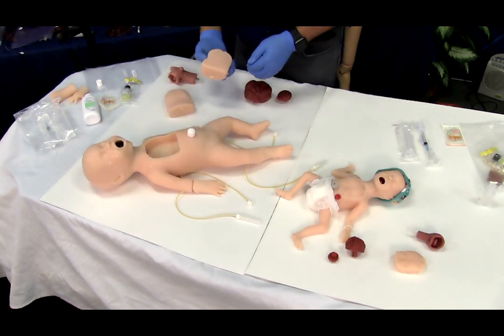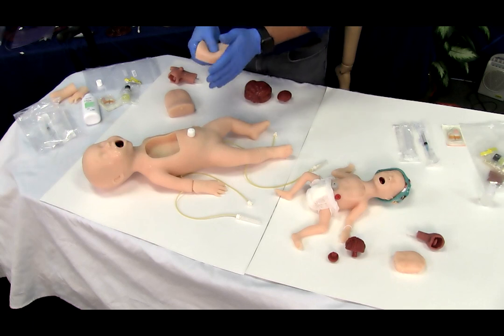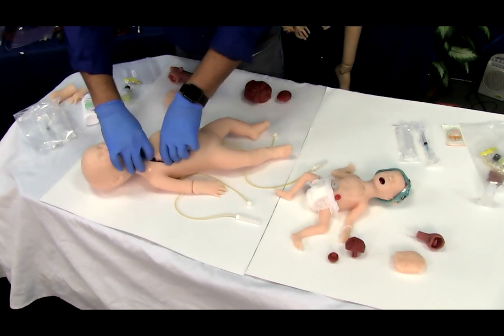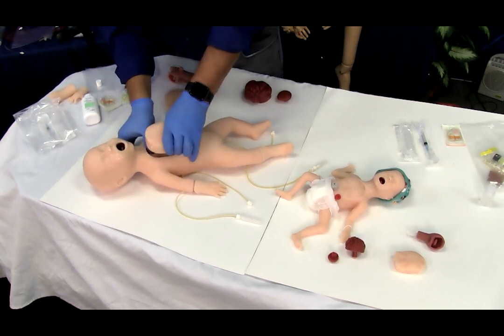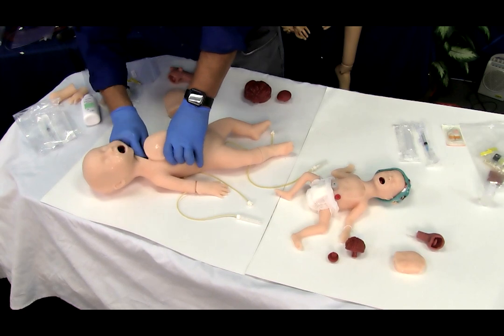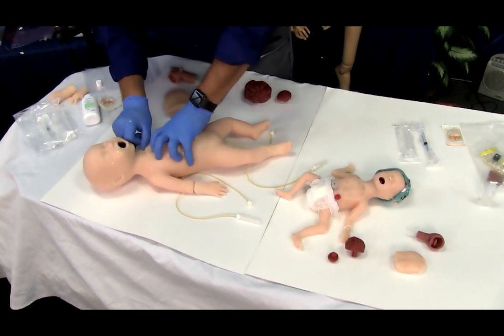Work your fingers around the inside of the mouth to be sure the airway is correctly seated. Check that the tubing section of the airway is projecting into the chest cavity. Lubricate the tubing section of the airway and place the lung plate, ensuring the tube from the airway inserts into the hole on top.